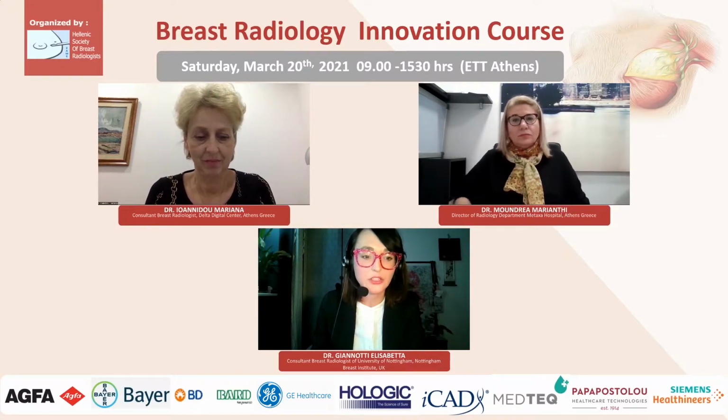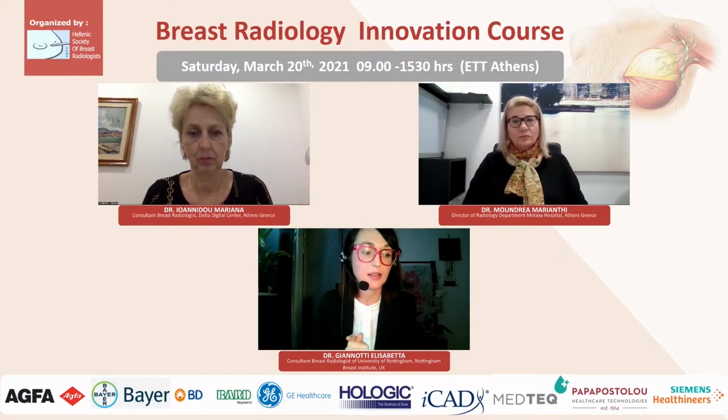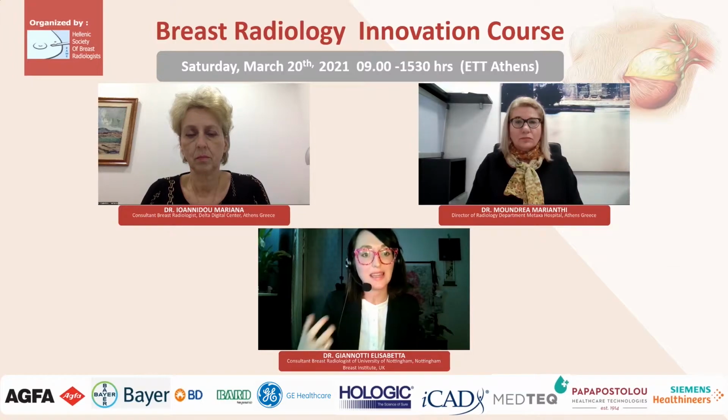Yeah, so unfortunately there are not many data about that, but we've done a little review, and we can see that contrast mammography is good, at least outperforming standard mammography. But I would be very interested to compare it to MRI, because I think sometimes the problem with contrast mammography is that we see the lesion, but not as intensely as on MRI.